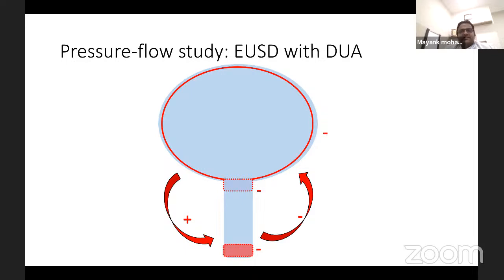Now, what happens in this pelvic floor dysfunction or sphincter dysfunction is that the external sphincter is not able to relax properly during voiding. Now, what happens when it is not relaxing properly? It is inhibiting the detrusor activity using the secondary reflexes. So, the secondary reflexes are confused. They are not letting the detrusor contract to its full potential because the sphincter is not relaxing. Now, remember, this does not happen in bladder neck obstruction or prostatic obstruction. It happens only in external sphincter obstruction.